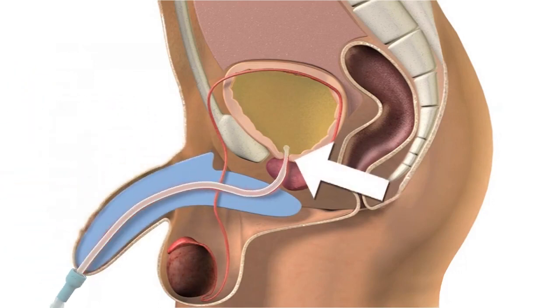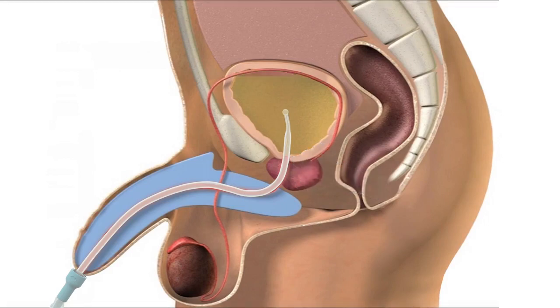It is normal that you feel resistance from the sphincter, so be gentle. Continue to insert the catheter until it reaches your bladder and the urine starts to flow. Then continue for a few centimeters further. When the flow stops, move a little and straighten yourself up to make sure that the bladder is completely empty. Withdraw the catheter slowly to ensure that you drain any remaining urine at the base of your bladder. Once any additional flow of urine has finished, slowly withdraw the remainder of the catheter.